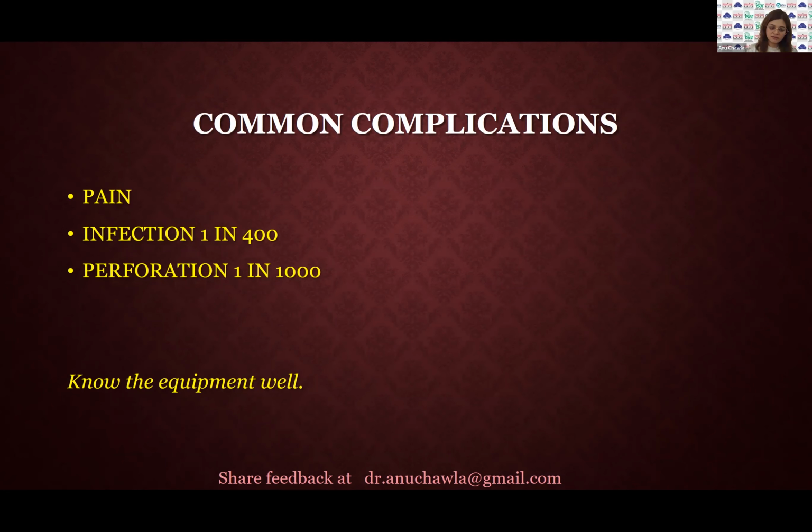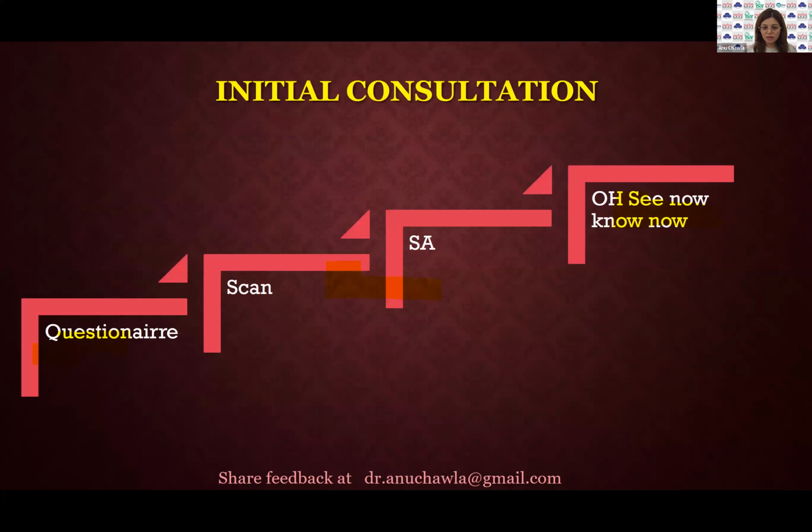Common complications are, of course, pain, infection in 1 in 400, perforation 1 in 1000. But when we know the equipment well, all the common complications really go low.